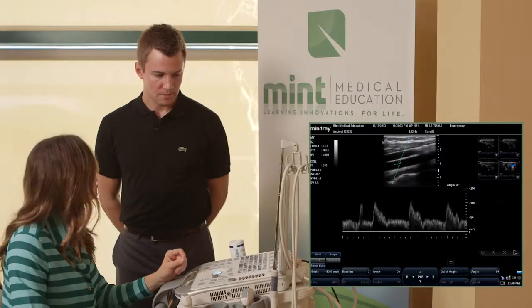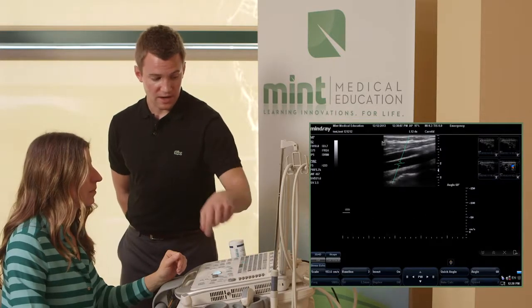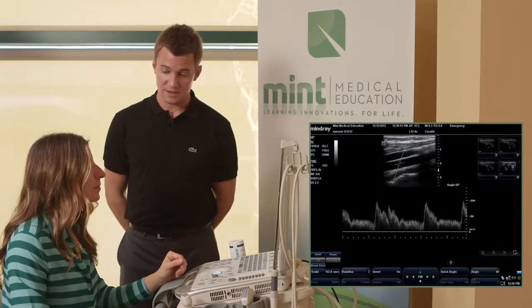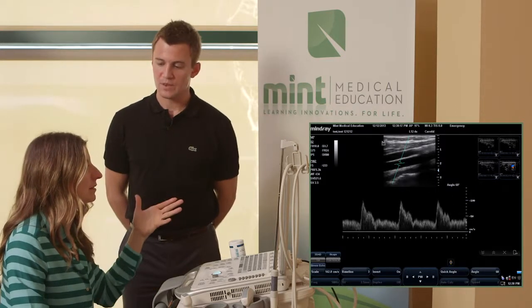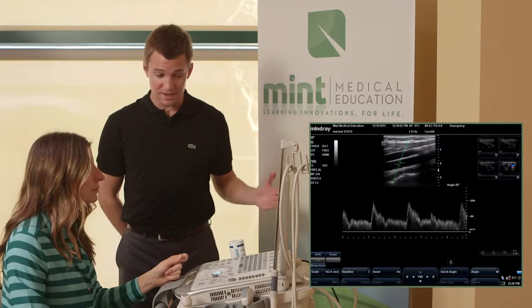Can you use iTouch to optimize? It actually works really well. If you have a strong arterial signal, like you do right now, if you hit iTouch, it does a nice job of adjusting your baseline and your scale. One thing that iTouch can't do is your invert. You want it in the right direction. Correct. You want to have it going the right way, either above the baseline or below.